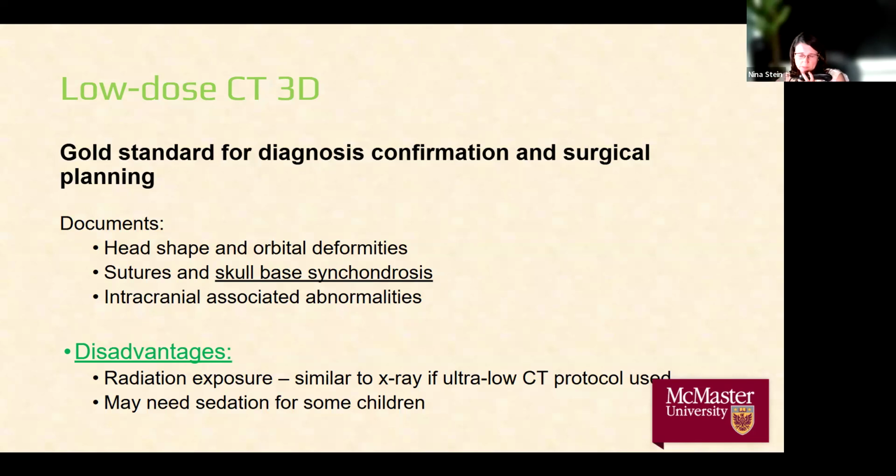Currently, I believe our protocol is 0.2 millisieverts. So it's still higher than X-rays, which is 0.03, but much better than a regular CT, which is usually around 1.2 millisieverts in full dose. The problem with this kind of examination is that you may need to sedate some of these children to get good imaging.